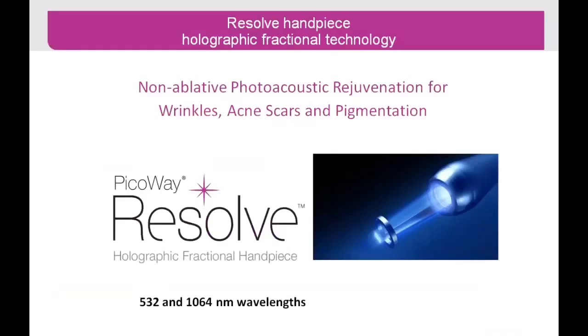So the Resolve handpiece comes in two wavelengths, the 532 nanometer and the 1064, and it's a fractional, non-ablative, photoacoustic way of generating tissue remodeling.